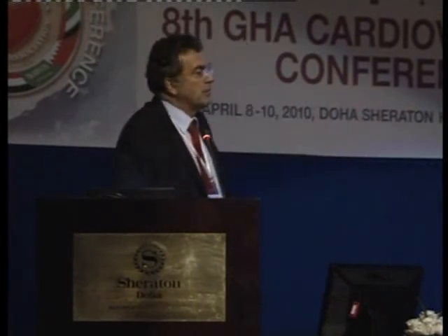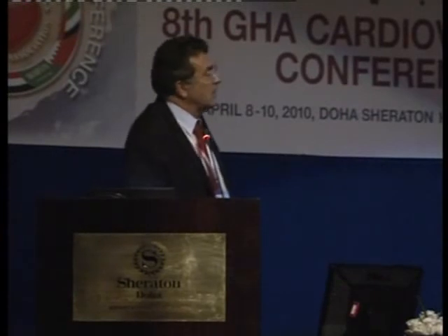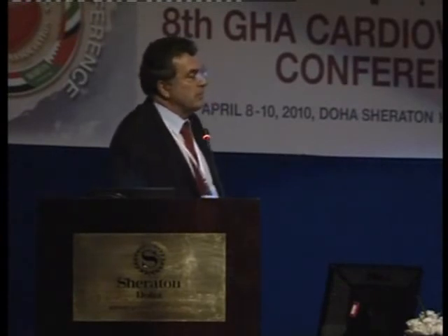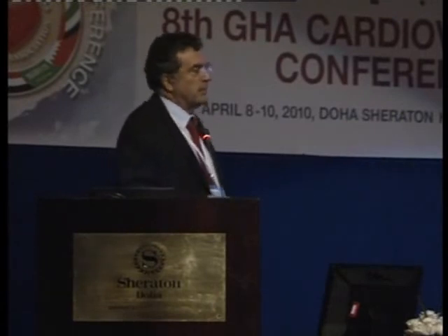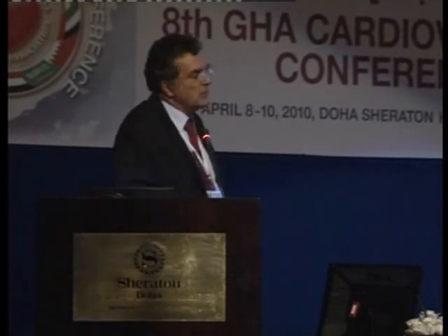Yes. Jean, I noted that this is the Volcano machine, which now has IVUS and FFR. Do you think that if you have this machine in your cath lab, it has 2 techniques, to go FFR first or go IVUS first and then go FFR in the artery to see the plaque morphology, and then evidence of functional ischemia in any side branch arteries, or you just, when you look to this, depending on the person who's doing the catheters, this could be an intermediate, so let us do the FFR for this.